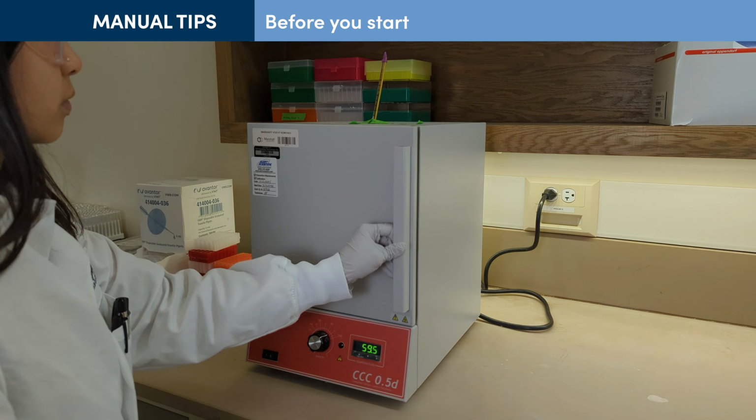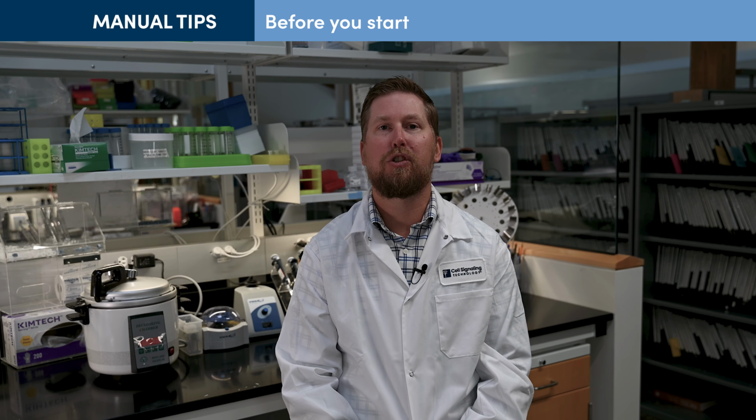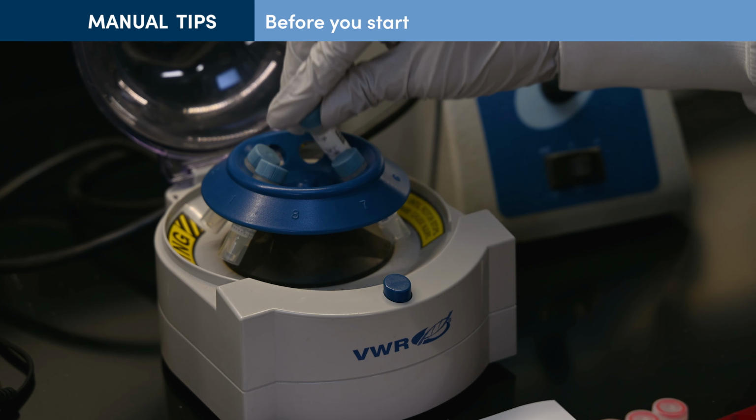Now we will cover additional tips for manual SignalStar, including when to prep materials and tips for antigen unmasking. A day before beginning the protocol, thaw these SignalStar kit components overnight at 4 degrees. Slide baking can be performed the day before as well. We recommend preparing solutions fresh before each round. This may be done during deparaffinization or antigen unmasking.